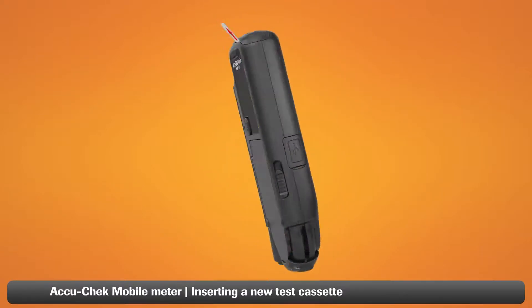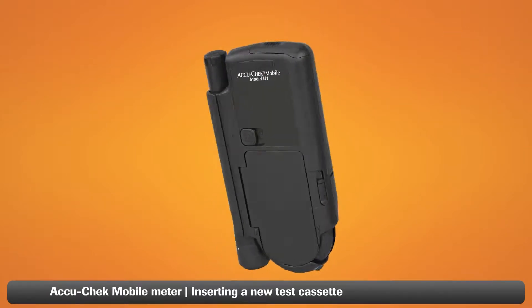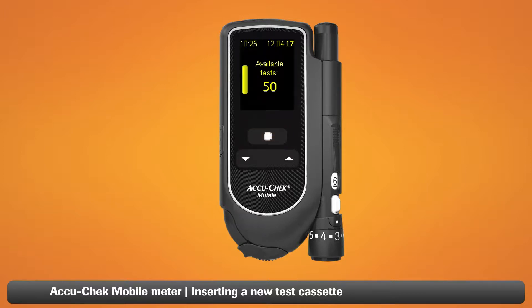If this is the first time you use your AccuCheck mobile meter, you will need to pull the protective strip of the batteries backwards out of the meter. You may also need to set the language. Turn the system on by holding the Power Enter button down for 2 seconds. The language screen is displayed. Use the up-down arrows to locate your language, press the Power Enter button to select it, and then press it again to confirm. Your system is now ready to use.